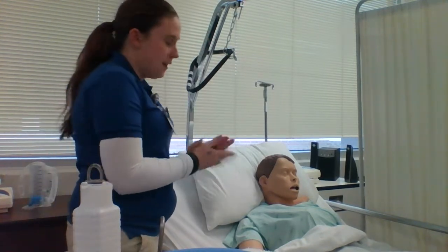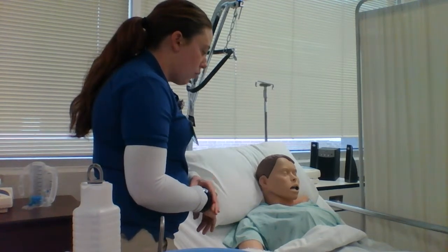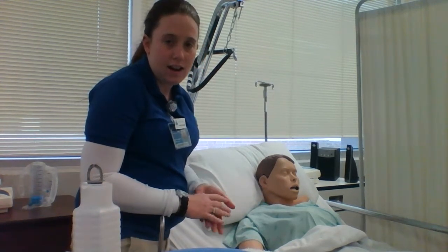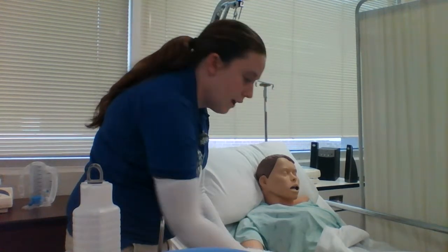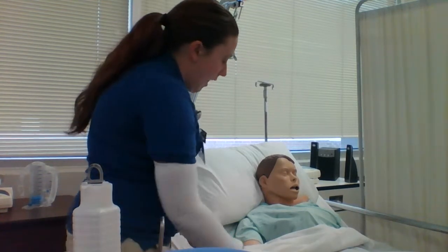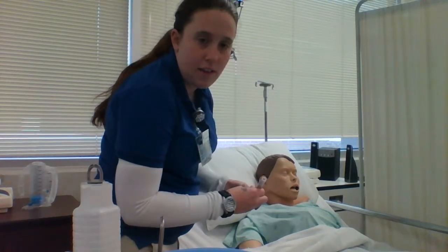I would wash my hands and introduce myself. Hi, my name is Brittany. I'll be your nurse today. Today the physician has ordered an NG tube, and I would explain the procedure and answer any questions that he may have. Could you tell me your name and date of birth? Okay, I've identified the patient.